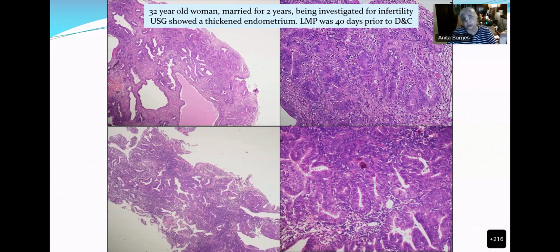Okay. The glands are showing you estrogen effects because they're disordered, they're branching, etc. And on the right-hand side, you see crowding. So what is that crowding and this proliferation? What should you call it? Simple, typical or hyperplasia without atypia. So what is this, Ruta? Simple glandular hyperplasia. So now you think this is simple on the right-hand side when you get crowding together.